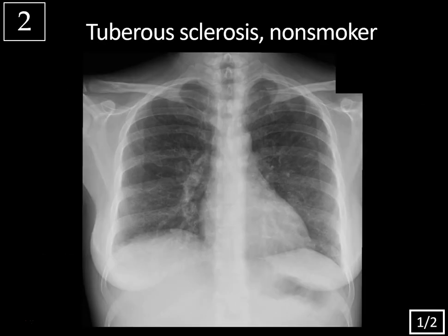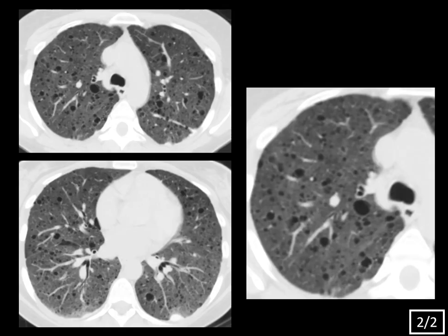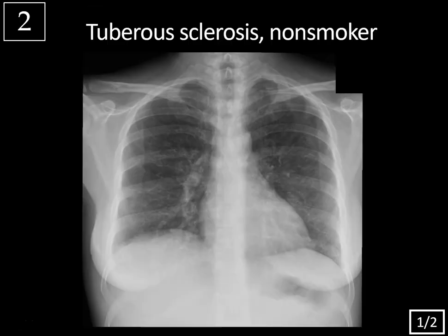Case 2: this is a chest X-ray of a patient with tuberous sclerosis who's a non-smoker. This chest X-ray is very subtle, but there is fine reticulation throughout the lungs, and that's due to the small cysts that we see subsequently on the CT chest. You can see one of these cysts faintly outlined in the right mid-lung.